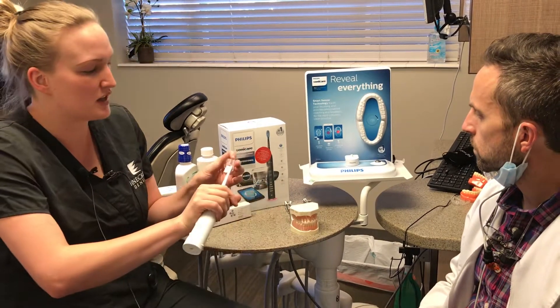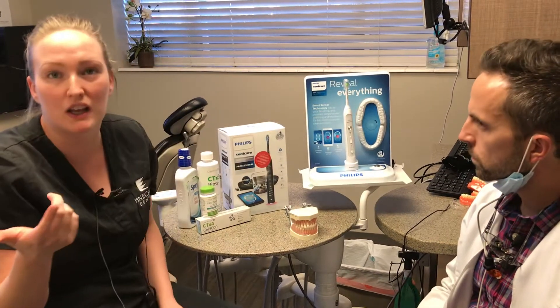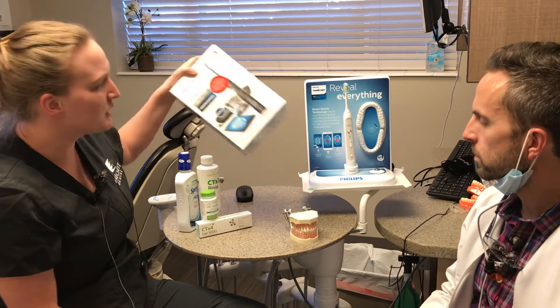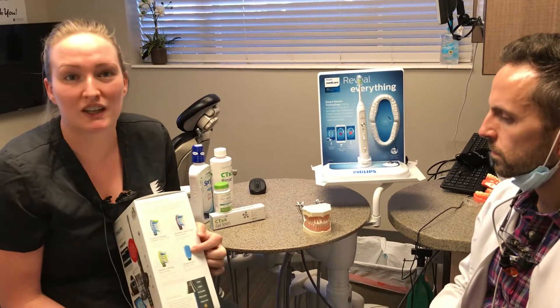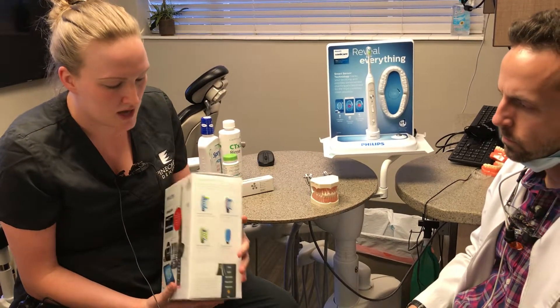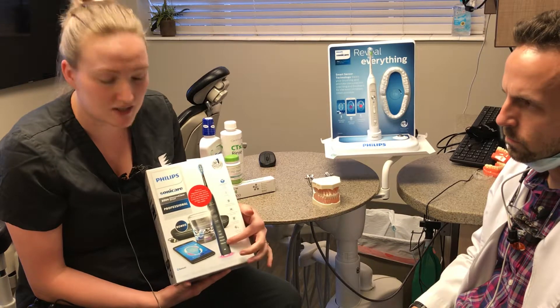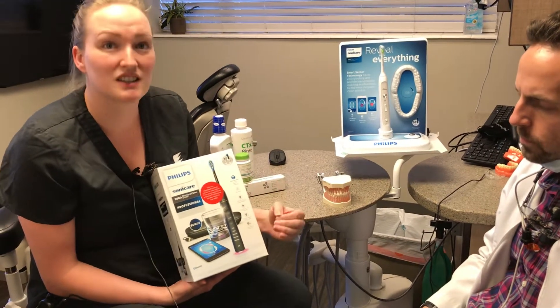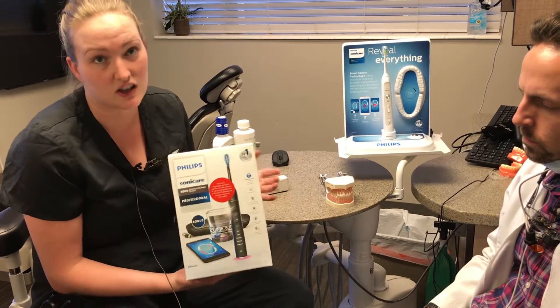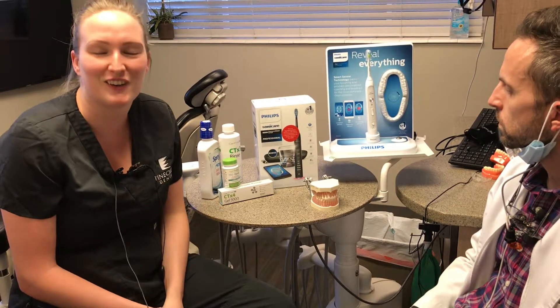The new Diamond Clean toothbrush that just came out comes in fun colors — a lot of couples do black and white, but there's also purple, pink, and rose gold. It also comes with a tongue scraper head, which is really nice especially this time of year when everyone's sick — it's a great way to clean your tongue, and you just rinse it off with hot water. There are lots of settings: a gum health setting for sensitive days, a deep clean setting, and a tongue care setting. When you attach different heads, it automatically switches to the right mode.